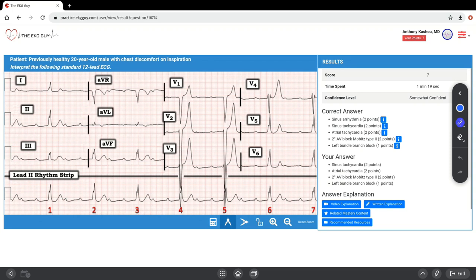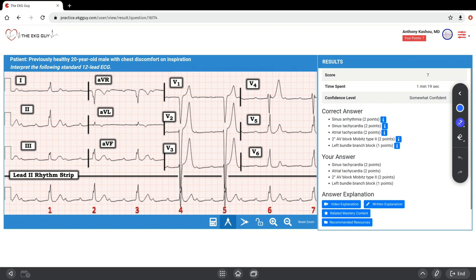In conclusion, how would we interpret this? Our final interpretation is sinus or atrial tachycardia with ventriculophasic sinus arrhythmia, second degree AV block Mobitz type 2 with 3 to 1 AV conduction, and complete left bundle branch block.